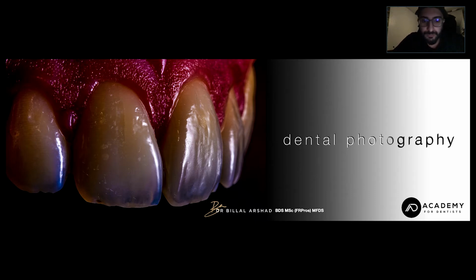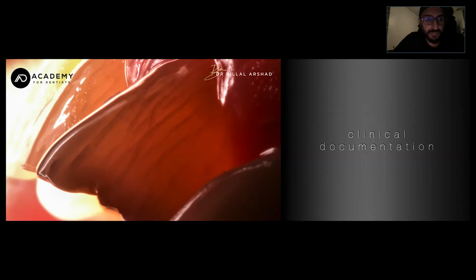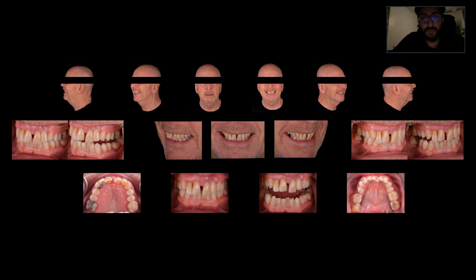Okay, so let's begin. One of the first things that I want to discuss is why is photography important? There are a number of uses for dental photography, clinical documentation being the first. When we take our initial photographs, we want a good set of portrait photographs, both with the patient resting and smiling, and good quality intraoral photographs as well. The purpose of these photographs is for us to document, to formulate a treatment plan, to present, etc.